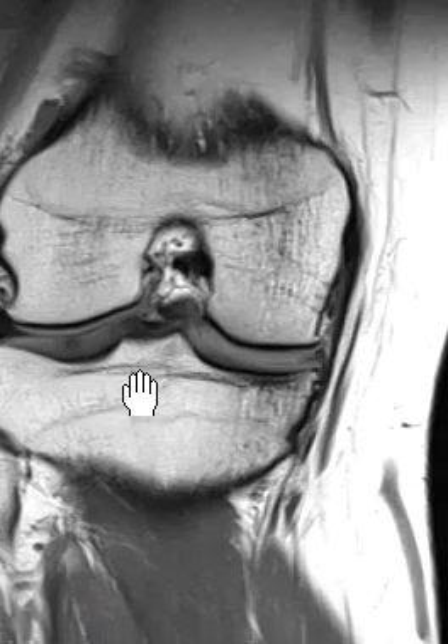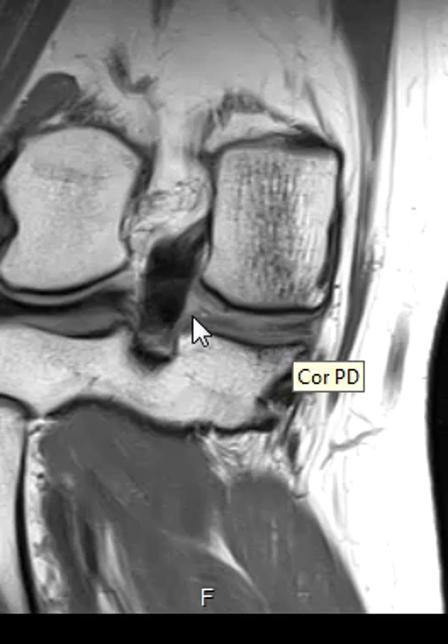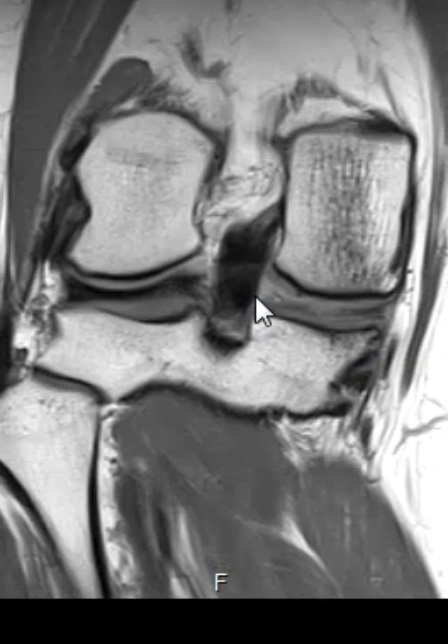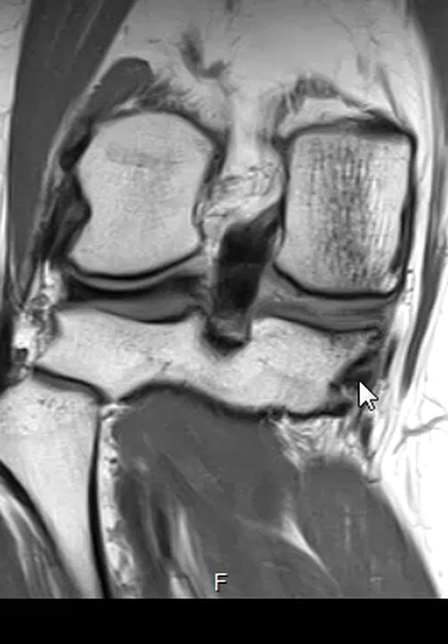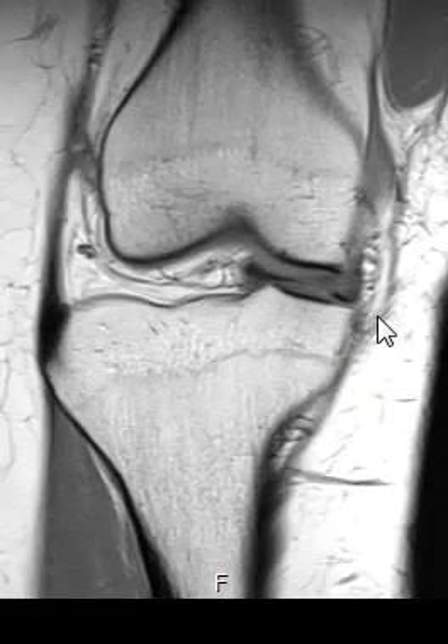If we go to the opposite, medial side, by contrast, we see that the meniscus doesn't look so good. Instead of being nice and smooth, it's frayed and very small. Towards the back, where we should see a nice big dark band like on the other side, instead we see just this patchy area of bright signal. This is a complex tear that goes all throughout the back of it, the side of it, and all the way throughout the front of it.